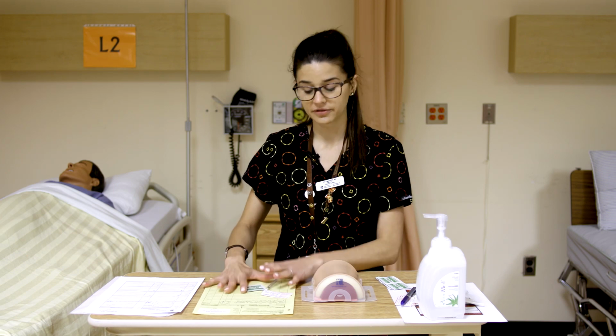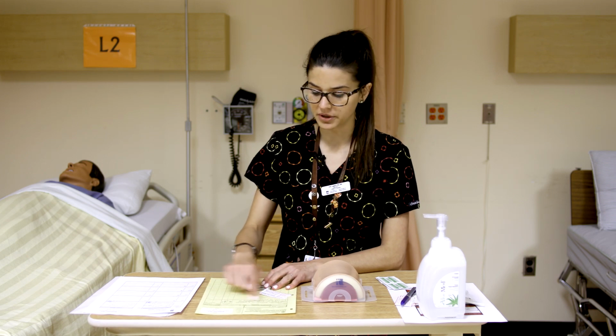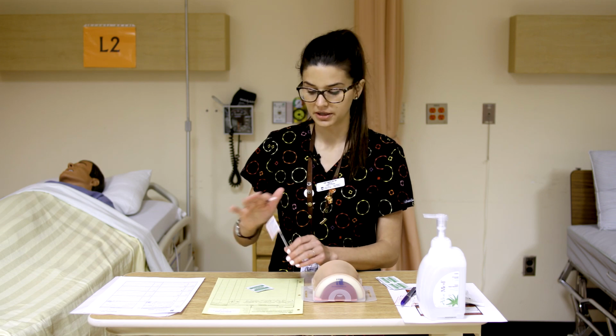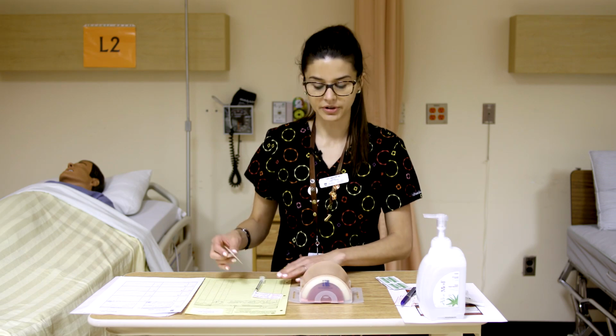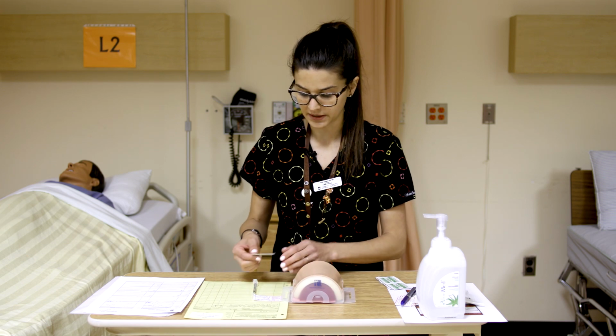And then you're going to perform your third and final check at the bedside. So again, reviewing your MAR with your syringe label, what's in your syringe and what's on your label. So we're kind of going to skip that just to get into the injection piece of it. But don't forget those. Don't skip over those when you are giving injections.